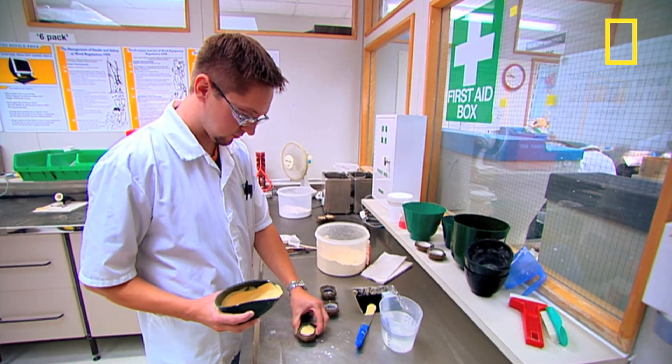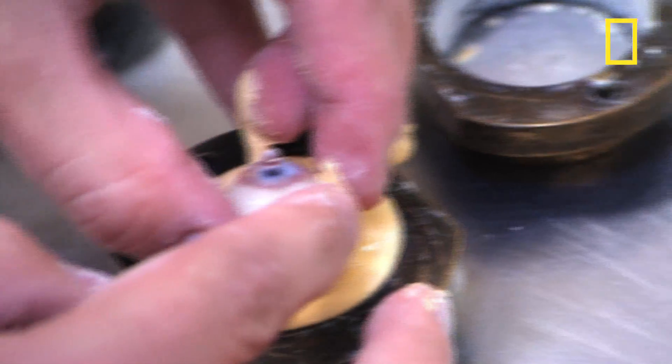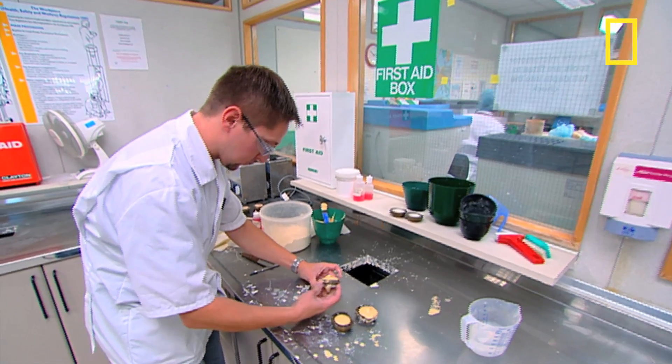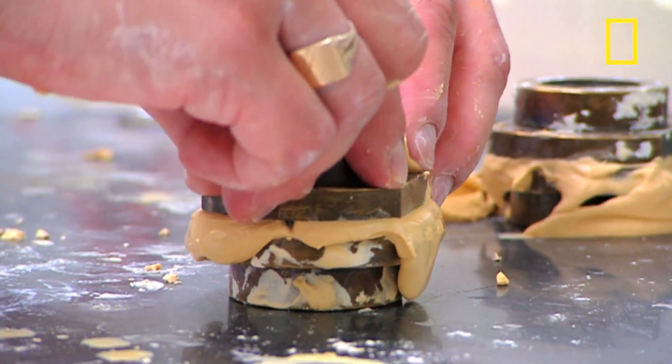Every single eye is made by hand to an exact order. A wax pattern of the patient's eye socket is sent here to the lab in Blackpool and a plaster of Paris cast is made. This produces a mold that is the exact shape of the eye that they're going to manufacture.